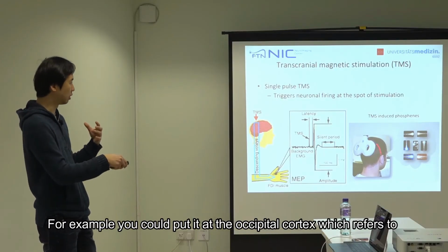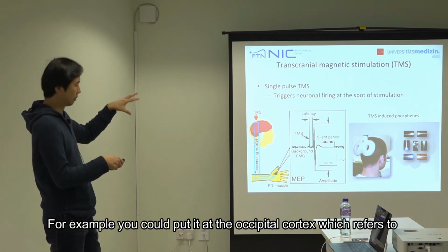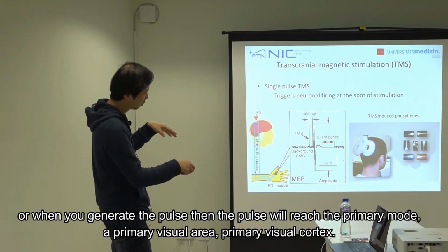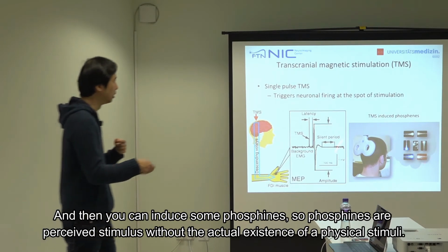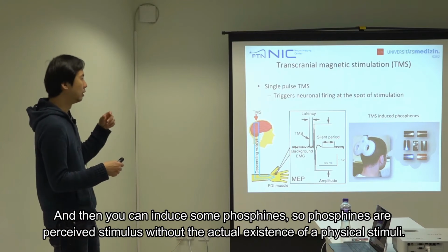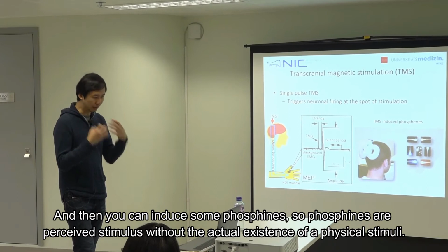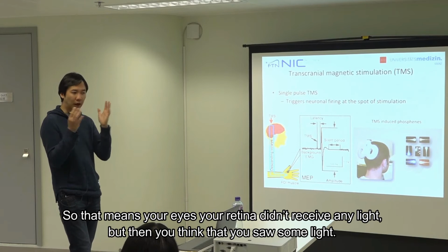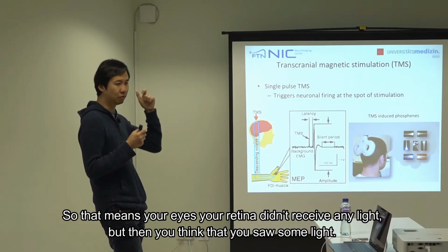You could also put the coil to other places in the head. For example, you could put it at the occipital cortex, so when you generate the pulse, the pulse will reach the primary visual cortex. And then you could induce some phosphenes. So phosphenes are a perceived stimulus without the actual existence of a physical stimulus. That means your eyes, your retina didn't receive any light, but you think that you saw some light.